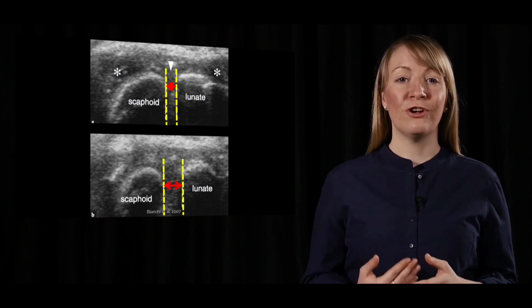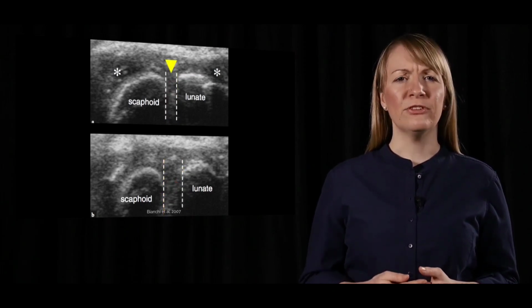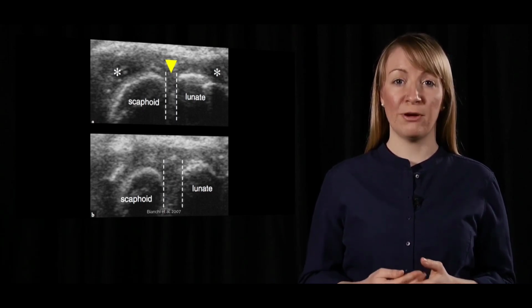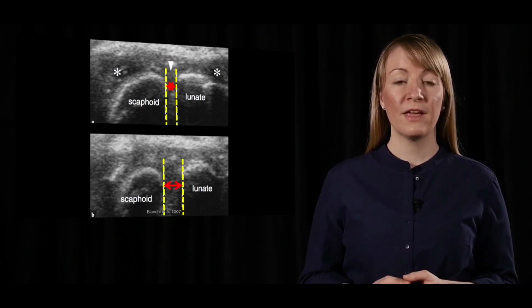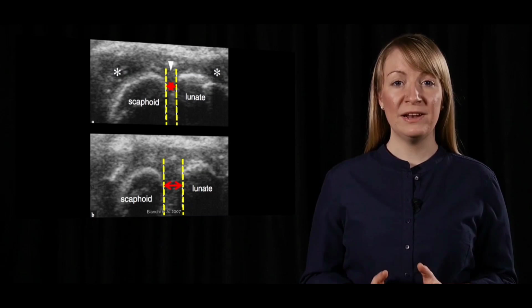The upper image shows the joint in a neutral hand position. Note the absence of the scapholunate ligament, a clear sign of fibre disruption and a change in fibre continuity. See the increase of joint gapping and thus the passive instability during ulnar deviation.